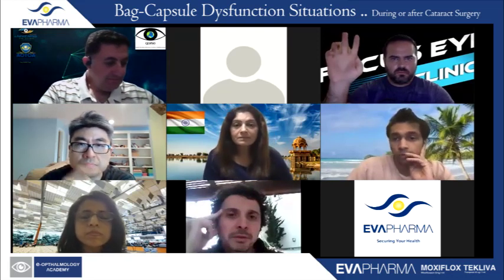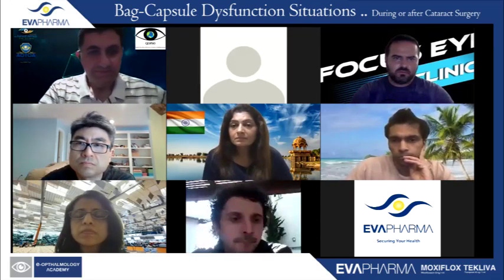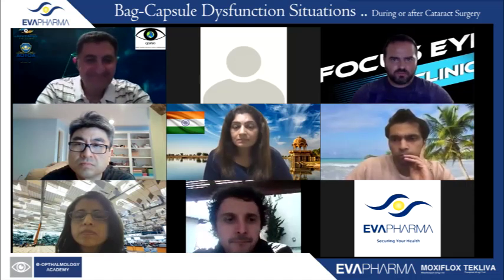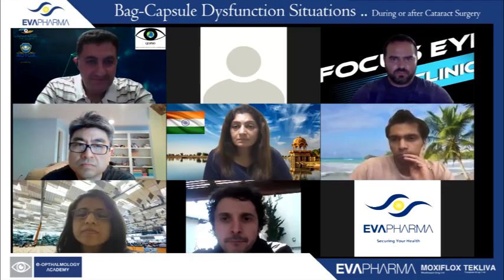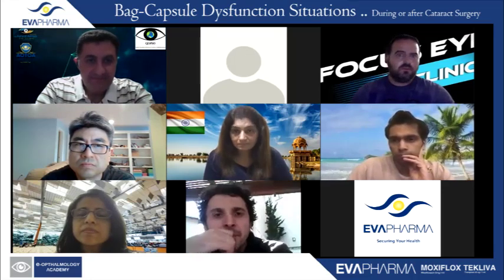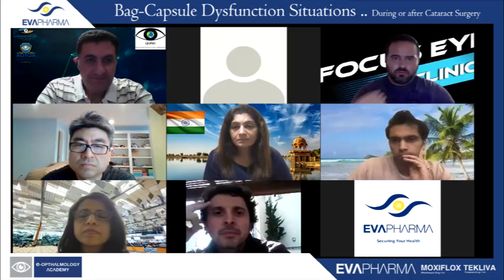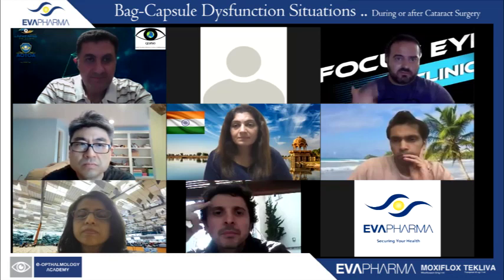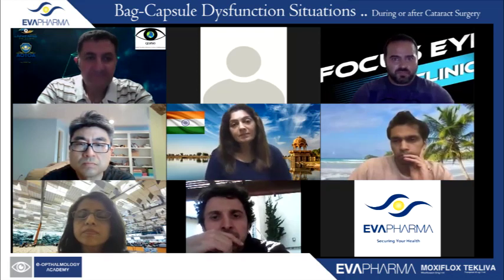Can I comment, Lukan? Yeah, go ahead. Actually, I'm against posterior pars plana vitrectomy. I'm a vitreoretinal surgeon, and if I'm going to preserve the capsule, I will do that from the anterior way. If the capsule is unsavable, then we go posteriorly, because when we go posteriorly, we will disrupt the base of the vitreous, and it might lead to different complications.